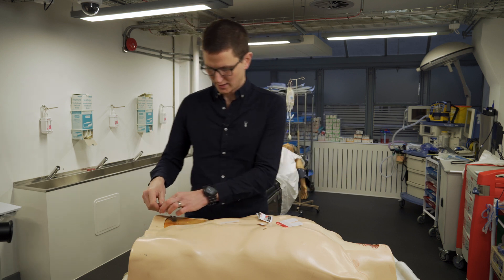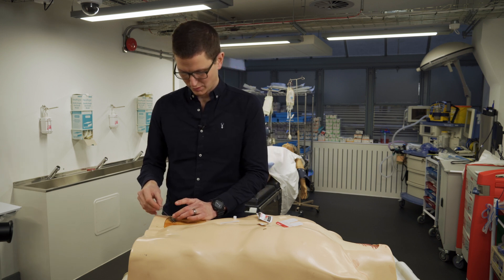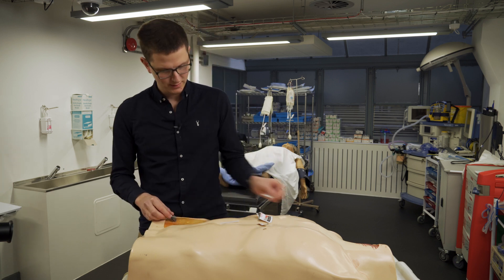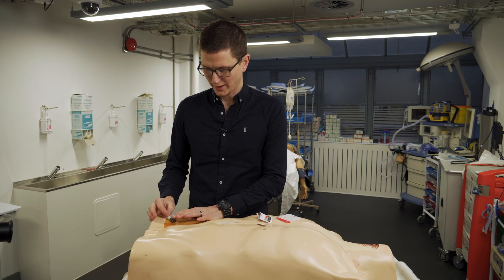It's the same process now. We're going to take off the back here and throw this away. That's in and that is attached. Then that can be tied down however you need to. Then we can give our fluids and drugs, whatever we need to give through that.